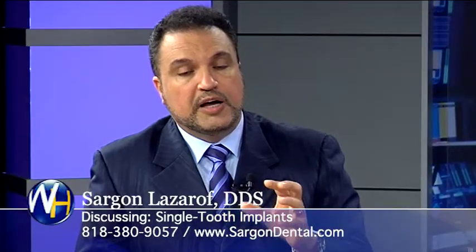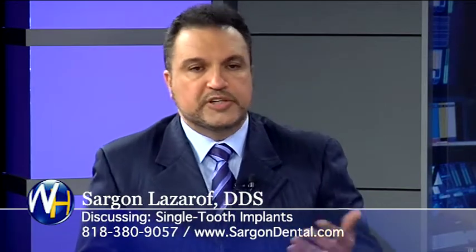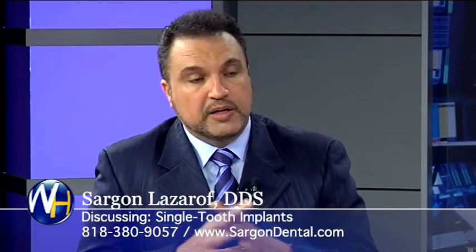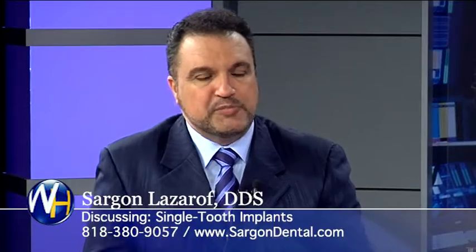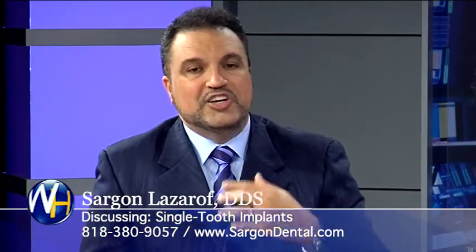So this can be done in the back. What about the front? Could you match those up? These are specifically for the front. Oh, really? In the back, it's not that important for the shape of the gum to be perfect, so some patients might decide it's okay to wait 2-3 months for it. But our glory is that in the aesthetic zone, the front teeth that you smile with, which is very important to have perfect aesthetic results, you can offer this immediate tooth replacement. So they walk in, and if they need an extraction, you remove the tooth, and then just get a tooth, and you put the crown on the same day and they leave.